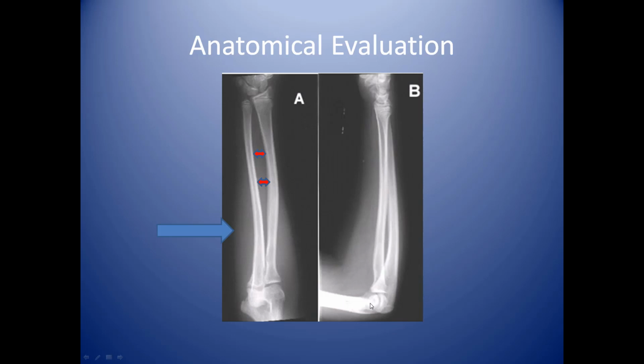Now look at the lateral elbow here. You see how the condyles kind of overlap one another. They form a little circle. So now you know this is a lateral, and of course this is an AP. They look a lot alike, but when you break it down and review it, you can pretty much tell which one is which. See this here? We see the distal joint spaces. This identifies, at least on the AP, we can look at the joint spaces in AP position.